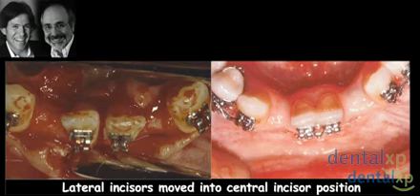What we decided to do in this case is something that has already been shown from forced eruption, but actually rather than extruding the teeth to manipulate the attachment apparatus, we decided to actually move the lateral incisors mesially towards the midline, actually making the lateral incisors central incisors and reconstituting the ridge dimension, both horizontally and vertically, utilizing orthodontics rather than additional surgery. So as an option to surgery, we reconstituted the ridge using orthodontics.